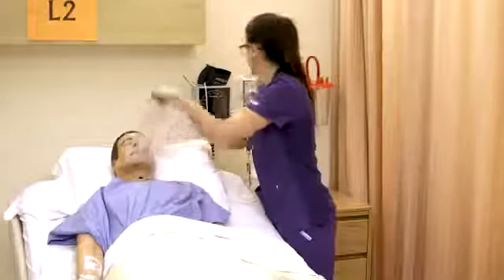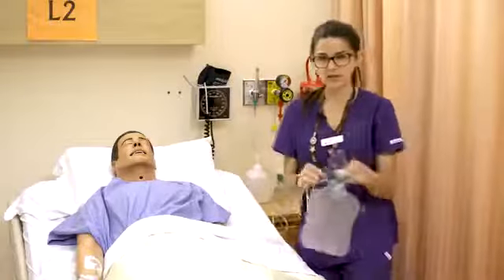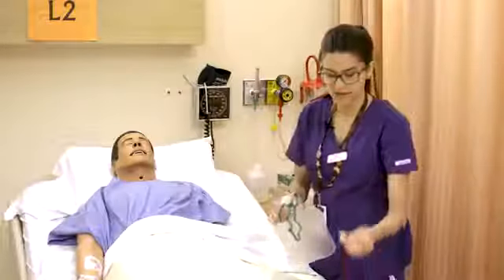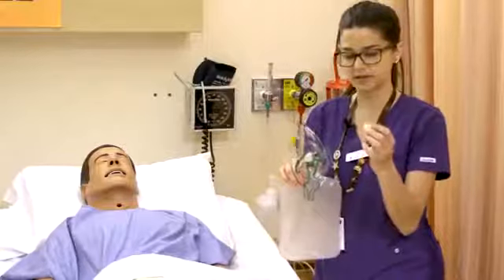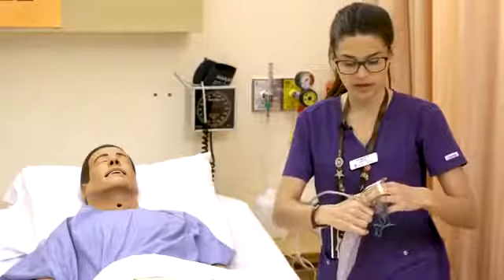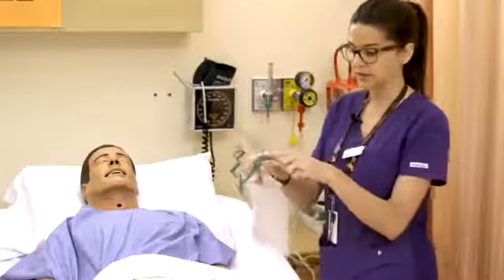So the difference between this one and a non-rebreather, or now it's known as a modified non-rebreather, is the use of the valves. In that package, like I said, it comes with these little white discs, or flexible discs. These are the valves. For the modified non-rebreather, you put a valve here, and as you can probably imagine or see a little bit, this acts as a one-way valve.